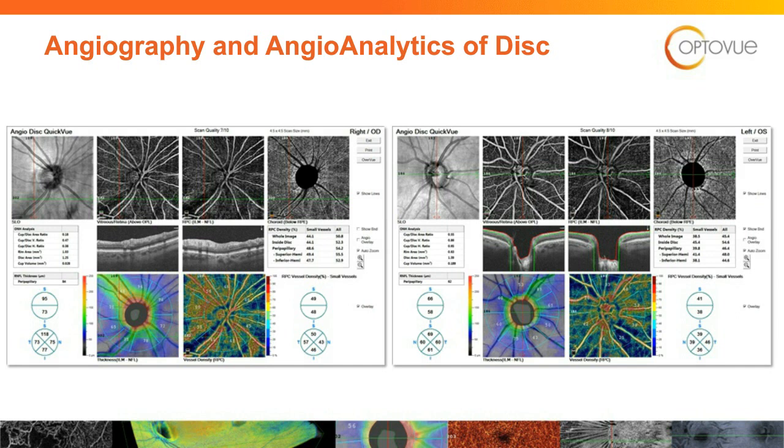But what's more exciting is if you go to the radial peripapillary capillary and the vessel density map, and look at that little wedge that's dropped out, you can see how that just matches the wedge defects that we see in the nerve fiber layer. If you keep going over, you can see that these numbers are the percentages. 49 and 48 is superior and inferior, but you can see down there in that inferior quadrant how it's a little compromised from that little wedge defect. Now remember, that's the right eye. The left eye is worse.